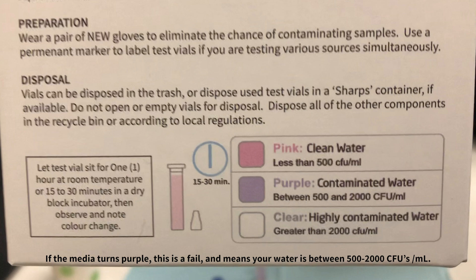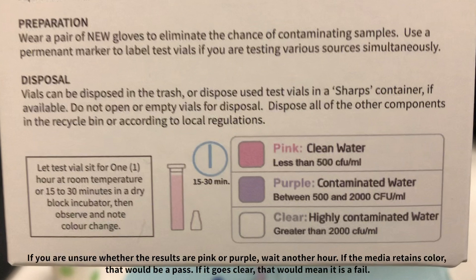If the media turns purple, this is a fail and means your water is between 500 to 2000 CFUs per milliliter. If the media goes clear, this is also a fail and means your water is over 2000 CFUs per milliliter. When observing the results, be sure to use a white background.